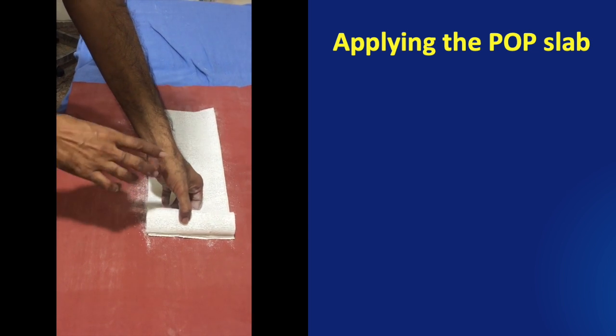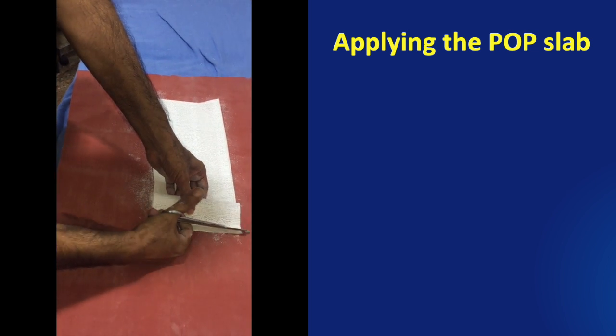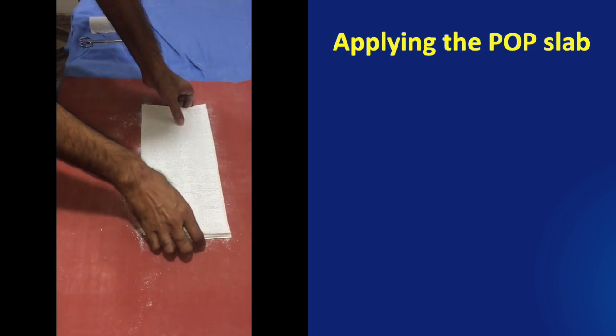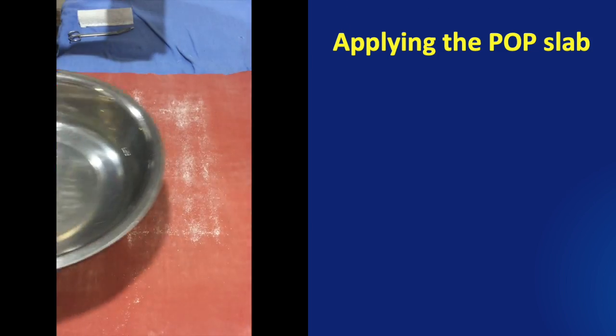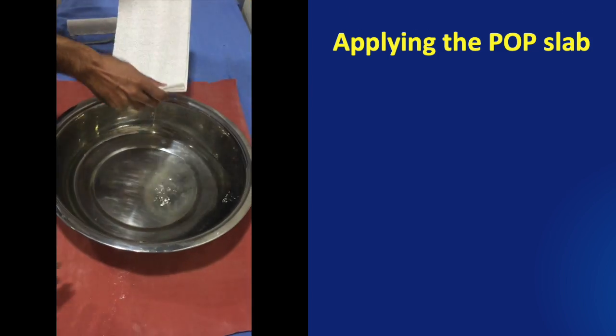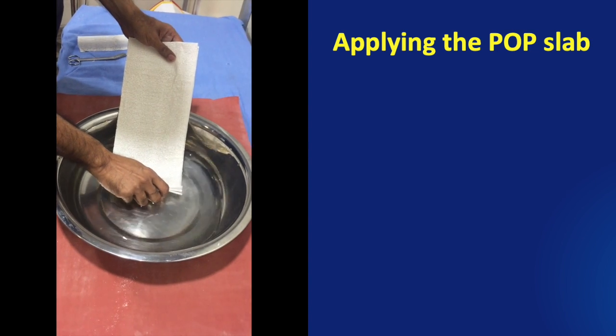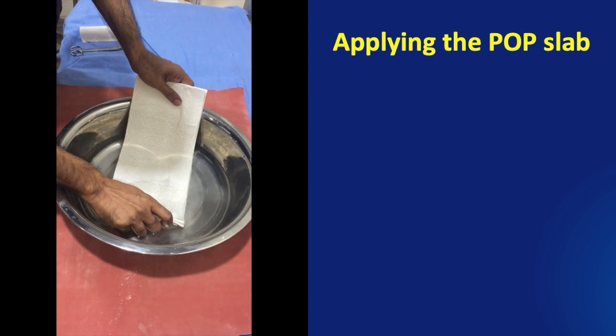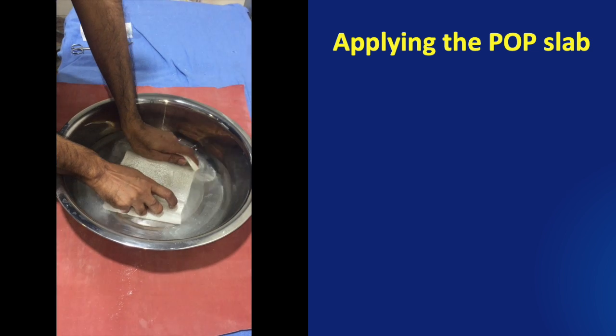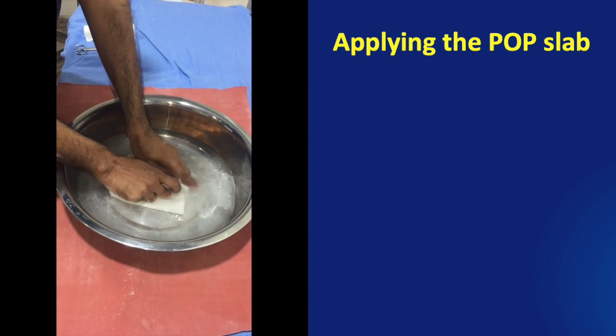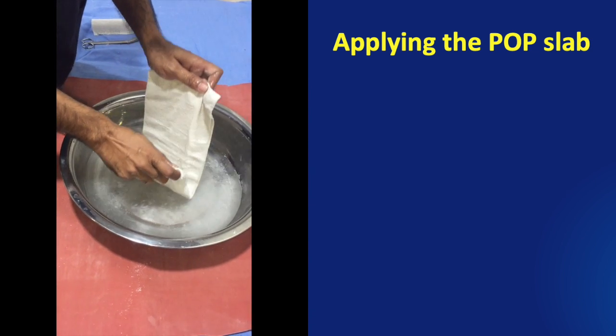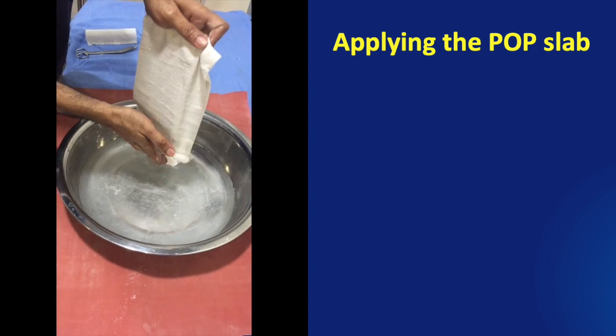Now after making the required length of POP we cut off the POP sheet. Now this prepared POP sheet is in layers. This has to be taken as a whole and immersed gently in the basin of water. We must allow all the air bubbles to escape. This will ensure that the water has reached every single part of the POP slab that we are preparing.